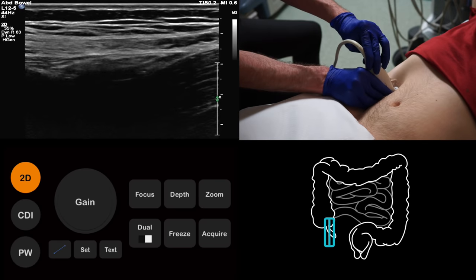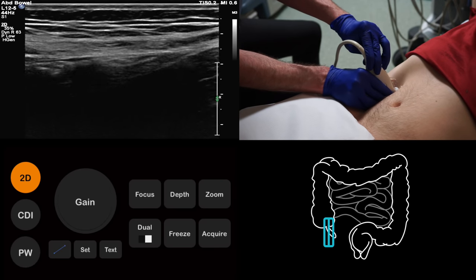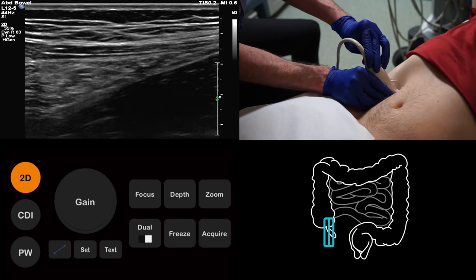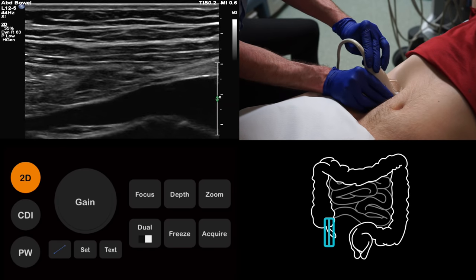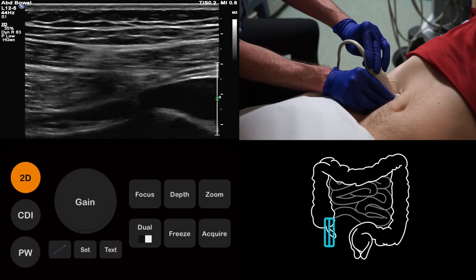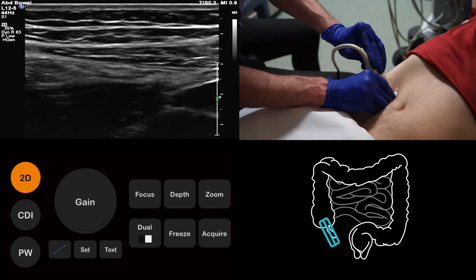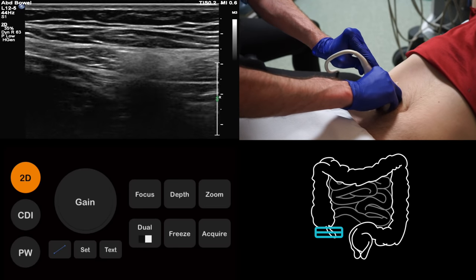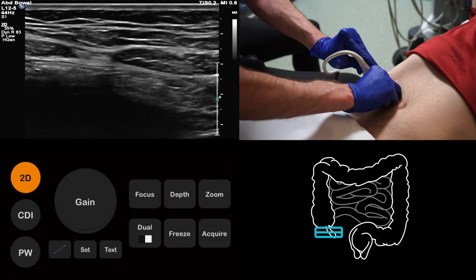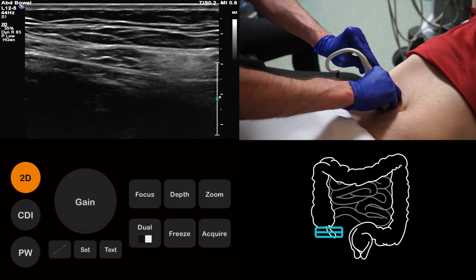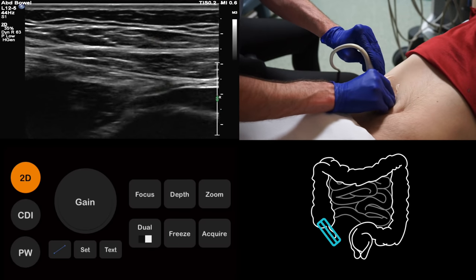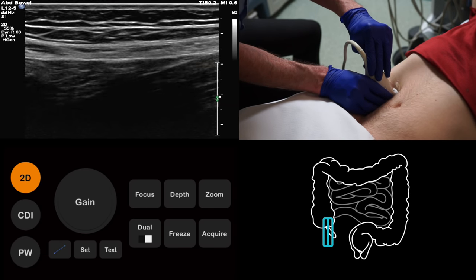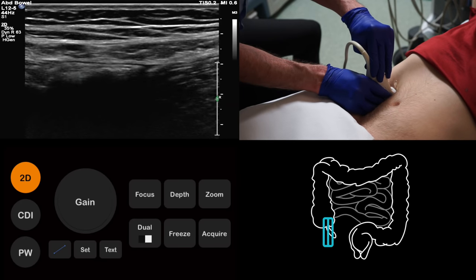Let's have another look at the appendix, this time without the arrow to point it out. See if you can identify it for yourself. If you are having difficulty, feel free to rewind the video and have another look. Trying to identify a normal appendix like this one is very difficult with ultrasound. As you will soon see, identifying an inflamed appendix is much easier.